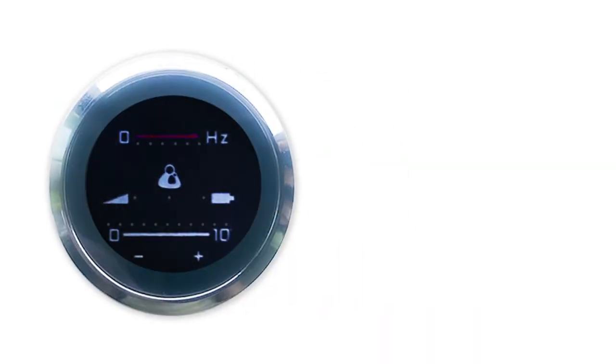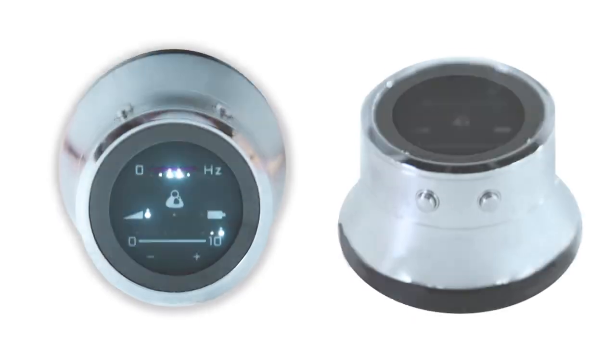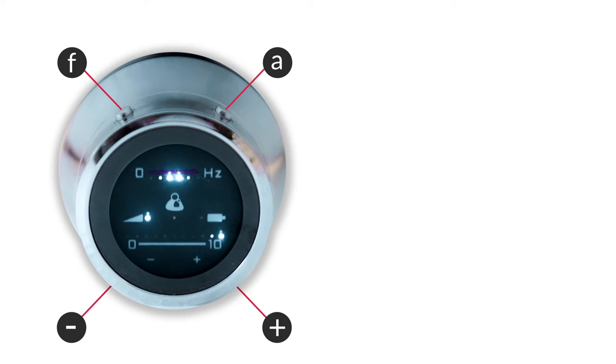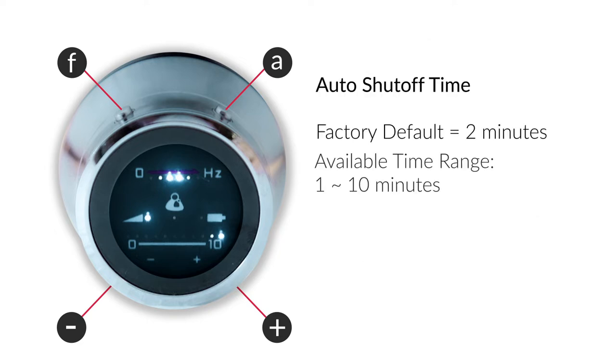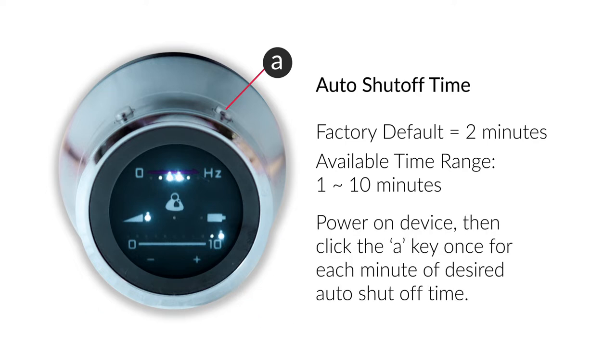Make sure your device is charged before use. The LED light next to the battery symbol on the device face indicates how much the battery is charged. To power on the device, press and hold any of the four keys around it. The device is configured to automatically power off after two minutes, so make sure the device is on when you place it on your body. To change the auto shutoff time, power on the device and click the A key once for each minute of desired auto shutoff time.